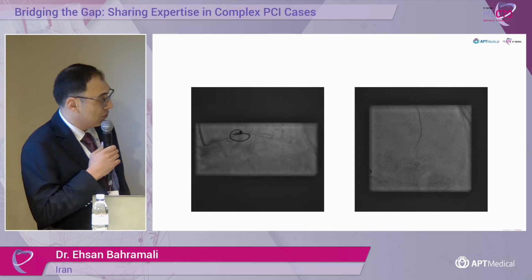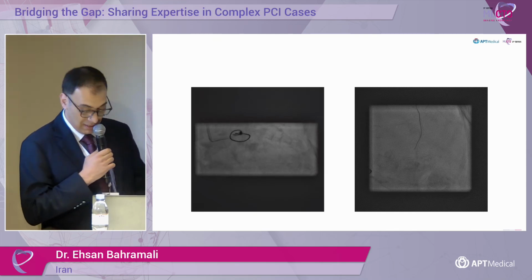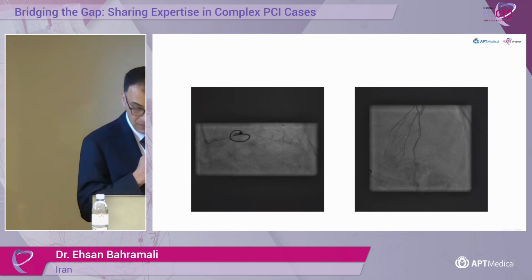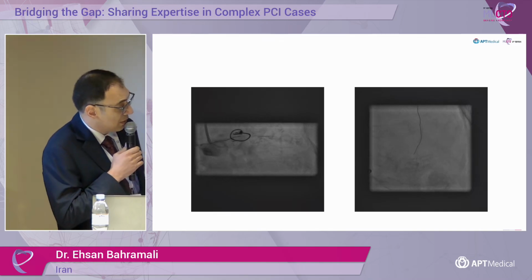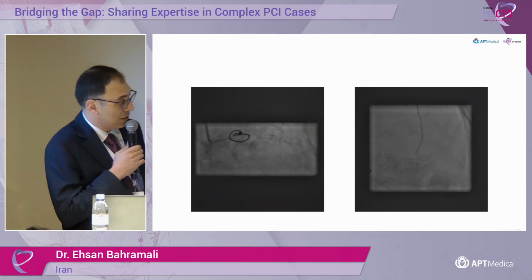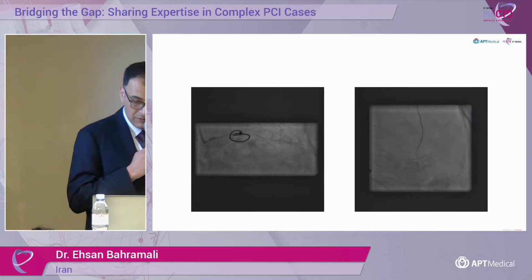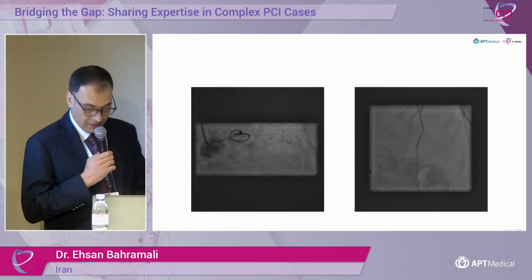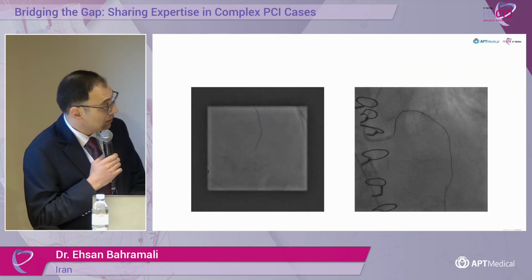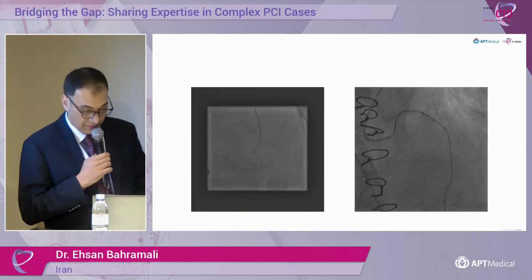This is an extra backup catheter from femoral access, and we had a left radial access to visualize the distal vessel. We started to navigate through the CTO with Sion Black. It didn't pass. We exchanged it for Gaia Next, and Gaia Next finally, after half an hour, passed through the severe calcification. This is when Gaia Next passes to the distal LAD.